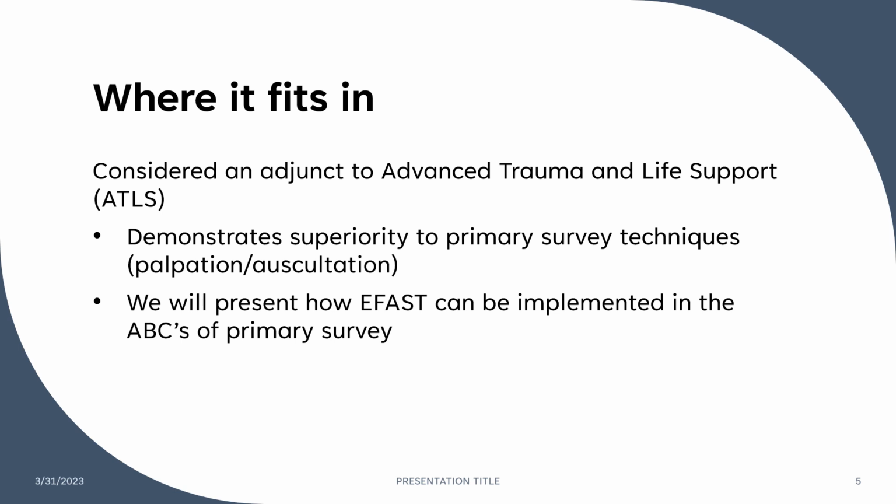What they found in a number of different studies is that utilizing ATLS with EFAST demonstrates superiority to primary survey techniques. Those things like palpation, auscultation, using our senses to evaluate, have been proven to be less effective than actually being able to visualize in real time with ultrasound. So this EFAST exam is used in combination with the ABCs of primary survey to provide optimal care.